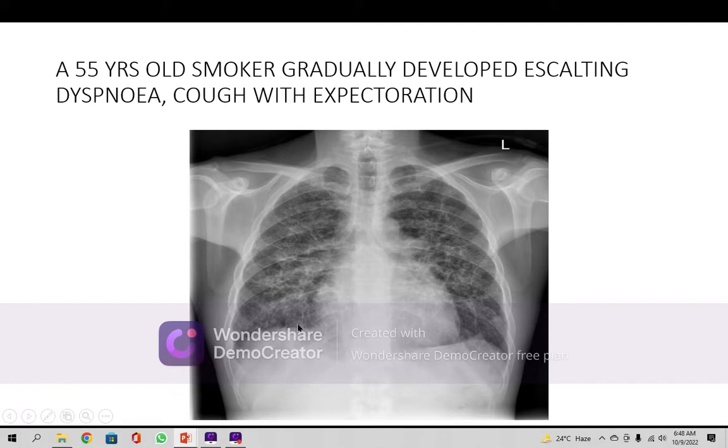You can see in this here, it is this one. What is called pleural thickening in our terminology. There is also tenting of the dome of the diaphragm. And another feature is this one: the pulmonary conus is more prominent in this condition. What is the disease? It is a chronic escalating disease.